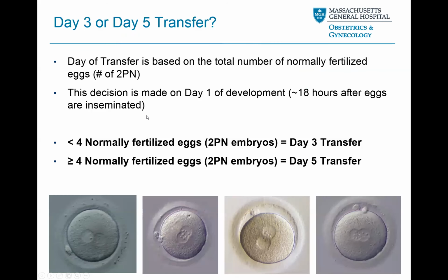So how do we determine when we're actually going to do these embryo transfers? This is a really great question, and a lot goes into this, and sometimes it can be a bit of a moving target, right? You look at your own internal data to determine what is best for the embryos, what's best for the patients.